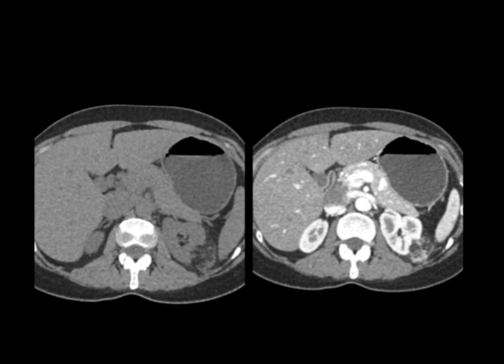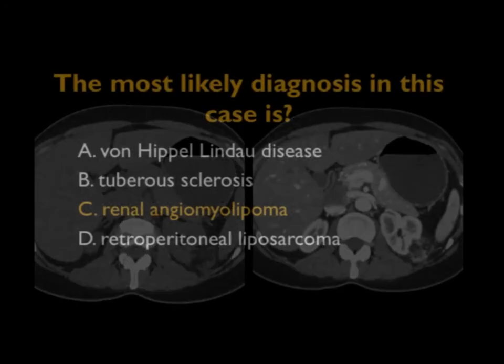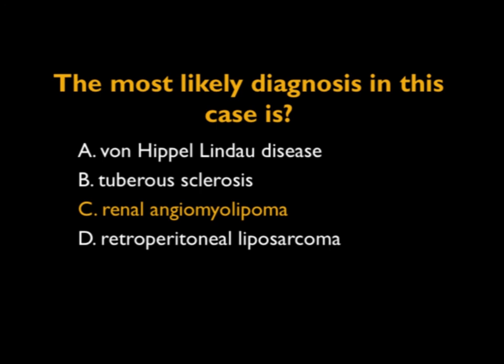Angiomyolipomas are benign lesions, but when they typically get over 4 or 5 centimeters, people will resect them because of the danger of bleeding. There is no predisposition to developing malignancies. You can see increased incidence of angiomyolipomas in tuberous sclerosis, but as in this case, they're most commonly incidental findings in 40 to 50-year-old females. A very nice example in this case, and this patient eventually, because of pain, underwent a partial nephrectomy.